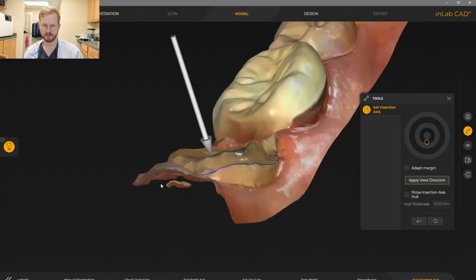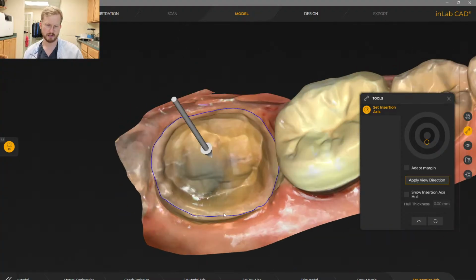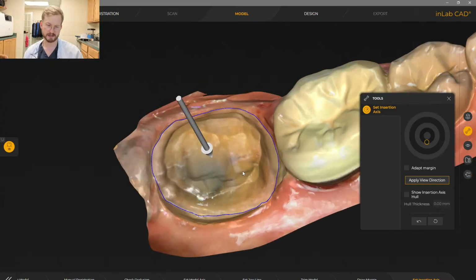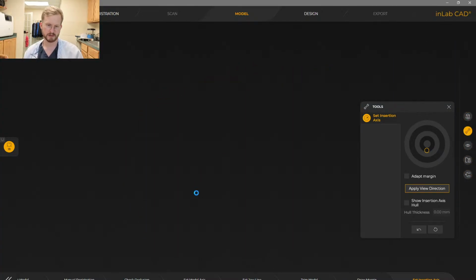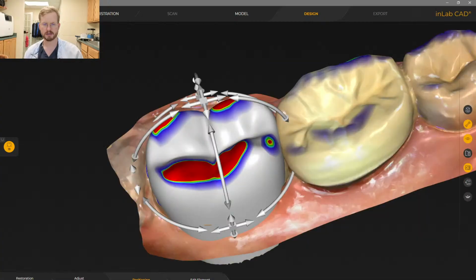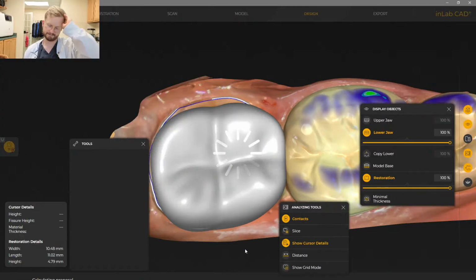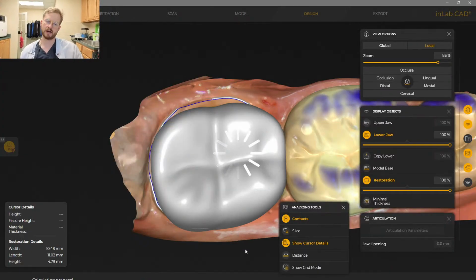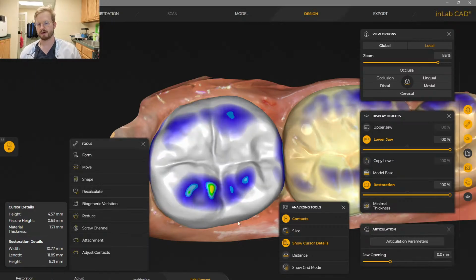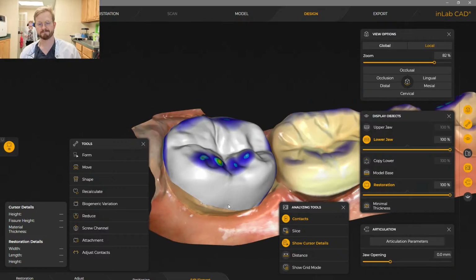Now, if I were you and I was looking at the tooth, I'd think, man, there's really not a whole lot there. It doesn't seem very tall. Ferrule's probably not going to help you keep that crown on much, but we can bond zirconia. We've got enamel all the way around our margin. We've got proper bonding techniques with 50 micron aluminum oxide to prepare the crown in the lab. We've got Monobond Plus as a primer or a silanating agent. And then we use our Scotchbond Universal adhesive and RelyX Universal resin cement.